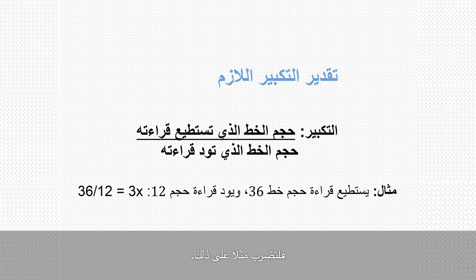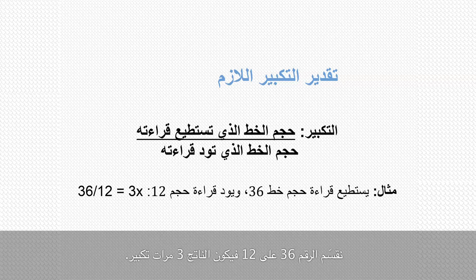Let me give you an example. If the patient can read font size 36 but wants to read size 12, we do a simple division sum. 36 divided by 12 gives us 3 times magnification. Now, for a brief spot task, this will be the end of the calculation.